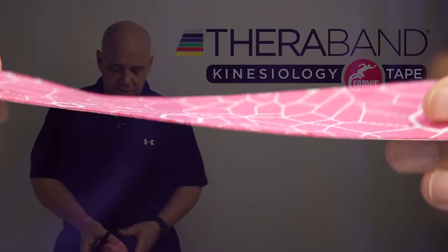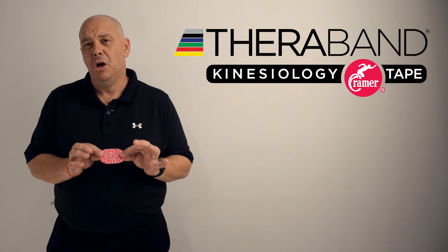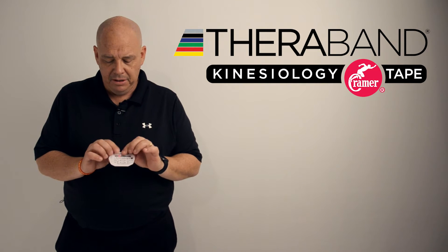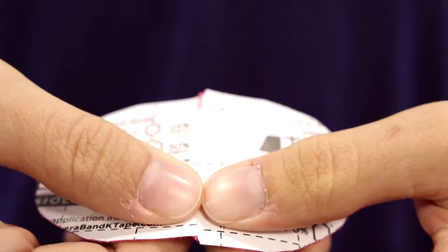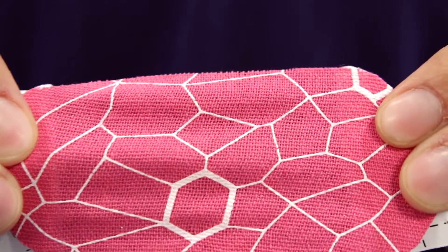Another cut I want to show — which we use when we need very small pieces for some applications — is what we call a band-aid tear. What you do is take the middle of the tape, break the ends, and then pull them apart in the middle. You can then pull those tabs back so you can apply your effective stretch between your hands in such a small location.